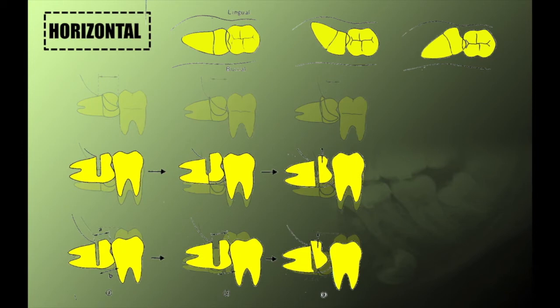Its width should be small enough to provide a snug fit for your instrument, to provide enough force for you to break the remaining part of the sectioned tooth. However, a small groove might make it easier to break the tooth sectioned portion, but in class 2 or class 3 impactions, the space created between the sectioned segments might be too small to allow complete delivery of the section, shown here in the diagram.